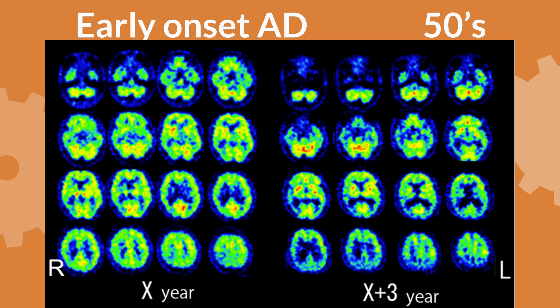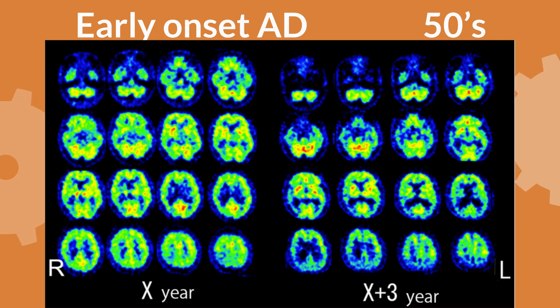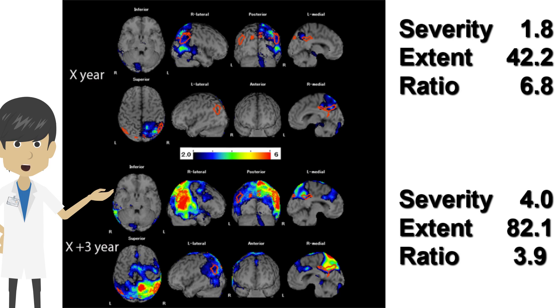In a longitudinal brain perfusion SPECT case of Alzheimer's disease with onset in the 50s, at year X there is decreased perfusion in the right temporoparietal lobe. Three years later, there is decreased perfusion in the bilateral temporoparietal cortex, more pronounced on the right. The EZI shows hypoperfusion in the right parietotemporal cortex and posterior cingulate gyrus to precuneus at year X, with high severity 1.8, extent 42.2%, and ratio 6.8 (thresholds: severity 1.2, extent 14.2%, ratio 2.2). Three years later, progressive bilateral temporoparietal and frontal perfusion decrease was seen; severity and extent increased while ratio decreased due to perfusion reduction extending beyond the specific VOI.